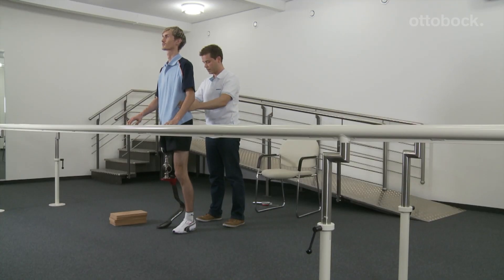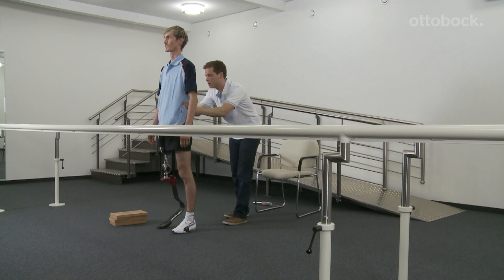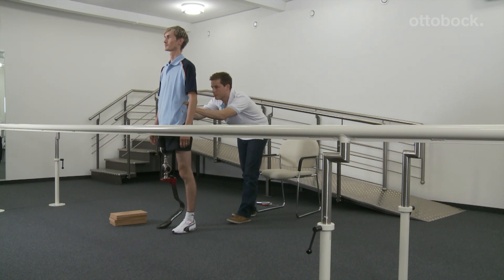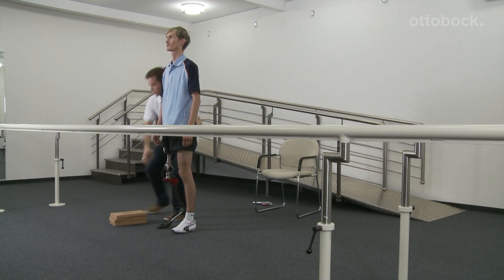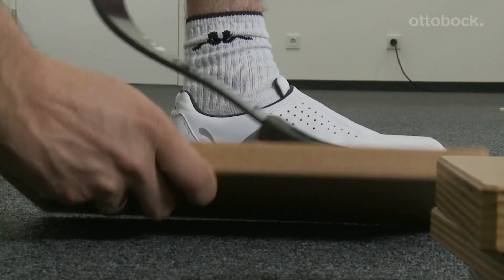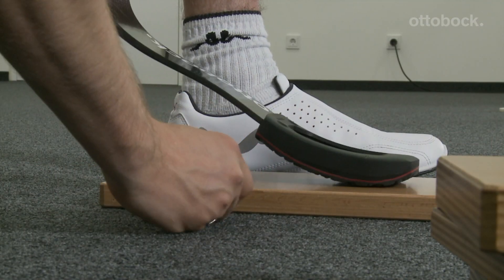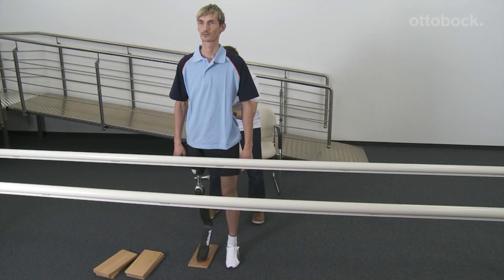For the user's first standing exercise with the prosthesis, it is necessary to ensure that the joint is locked and the user is standing by parallel bars. At the beginning, the technician stands behind the user in order to prevent a fall. The user maintains his balance, the load is placed on the prosthesis, and the residual limb is extended. If the prosthesis length is adjusted correctly, the pelvis is balanced.